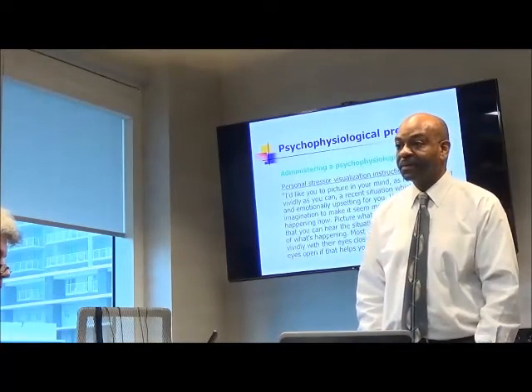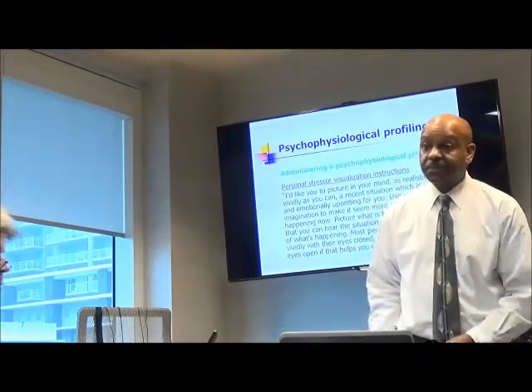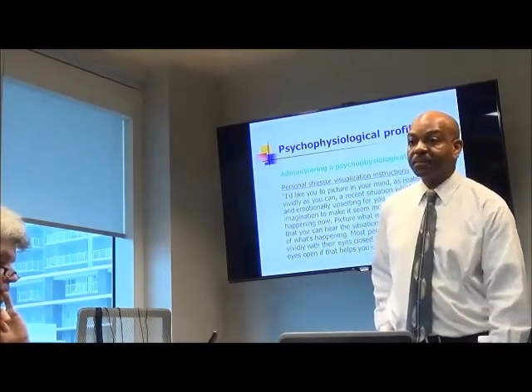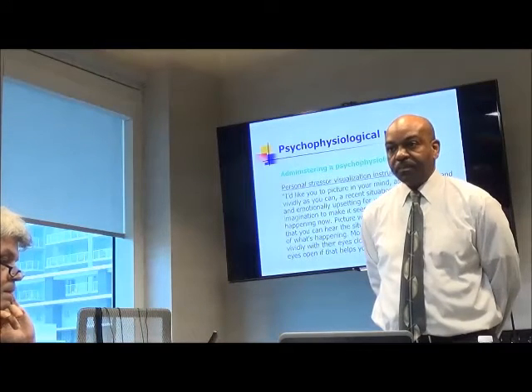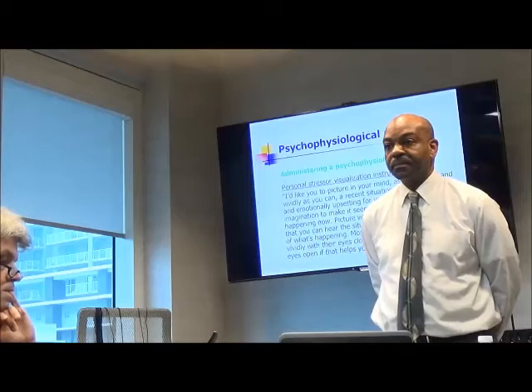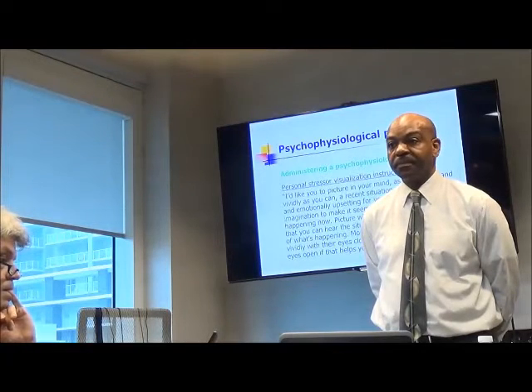Can I ask you about the soldiers, the trauma and so on? I don't ask them to tell me about their trauma. So I'm very careful when I say think of a stressor situation. I specifically tell them not to discuss a wartime experience, because for some of them it's very vivid, and I don't want to have a situation where that happens.